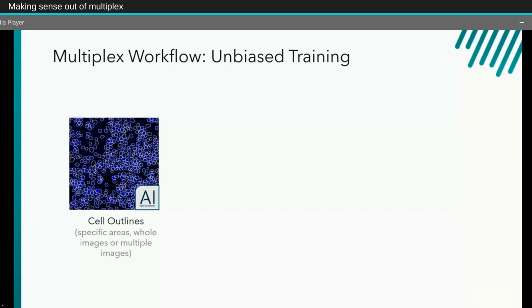To take just a second, we always use AI deep learning tools to do cell detection, chiefly because it can cope with the wide variance that we often see. This could be variance in cell size, cell shape, or cell intensity. It also provides a more robust solution to highly clustered environments where cells can be much more easily separated.